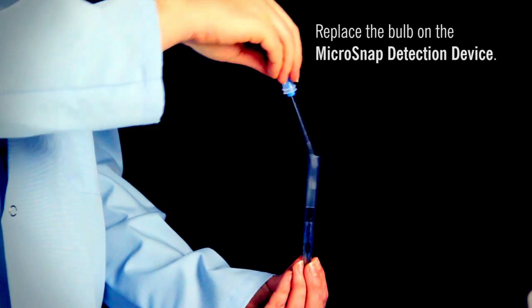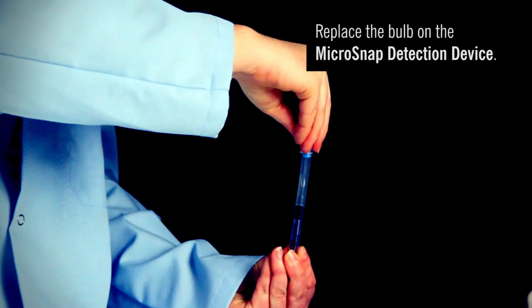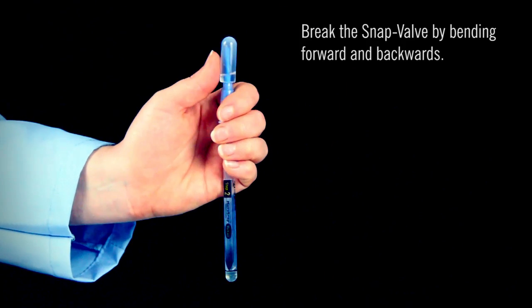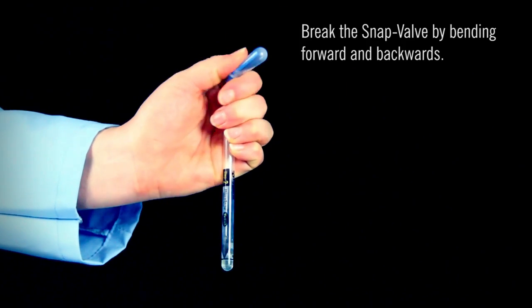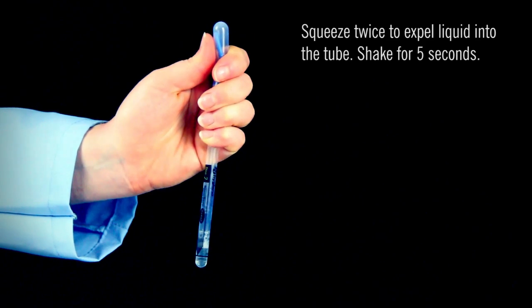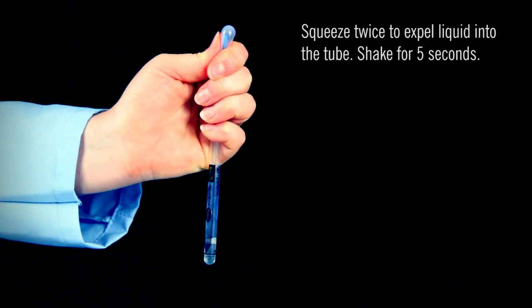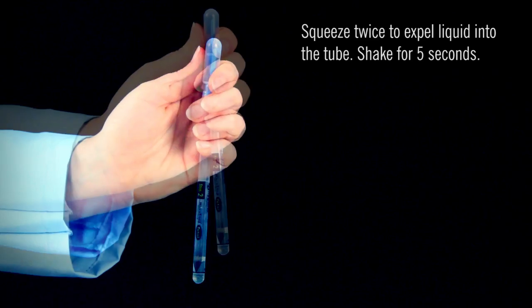Replace the bulb on the detection device. Hold the device in your fist and use the thumb and forefinger to break the snap valve by bending the bulb forward and backward. Squeeze the bulb twice to expel liquid into the tube and shake for 5 seconds.